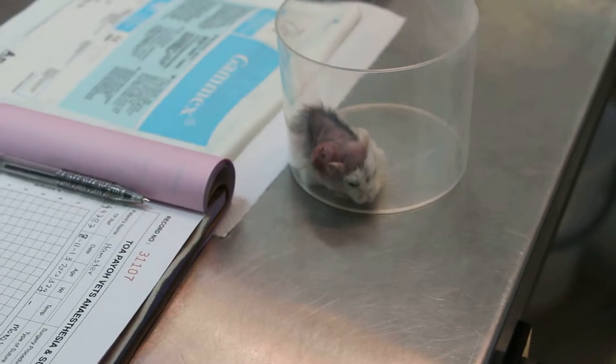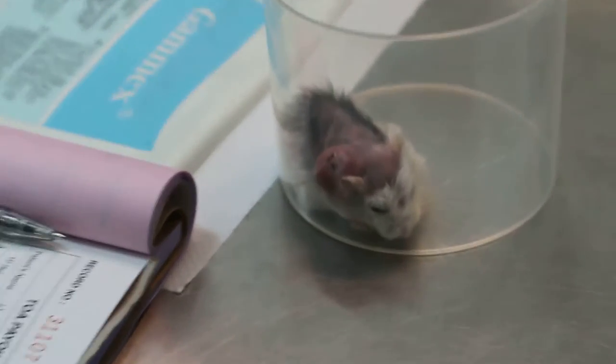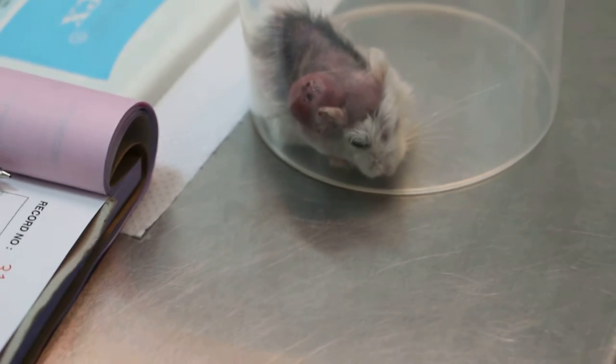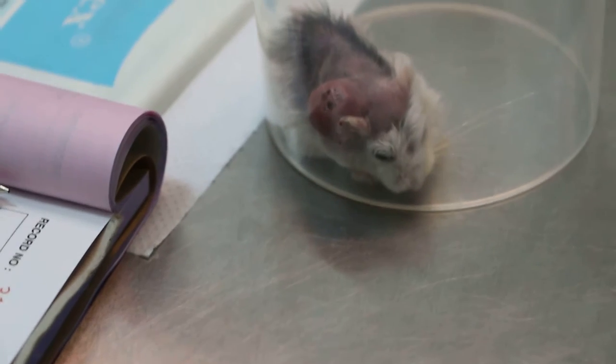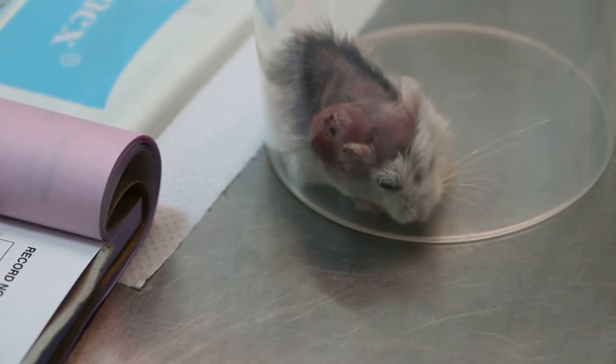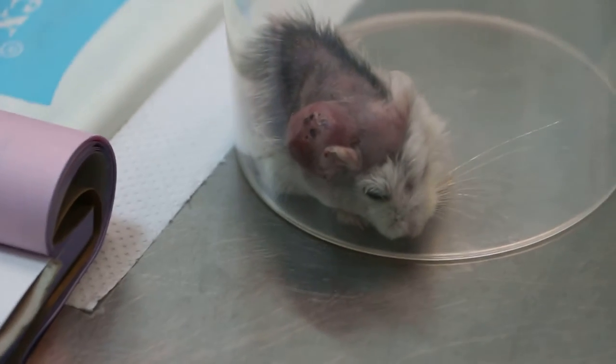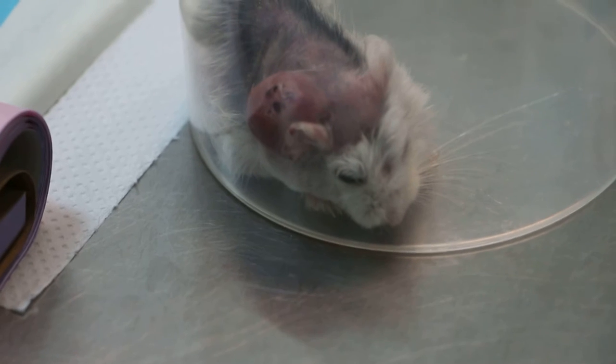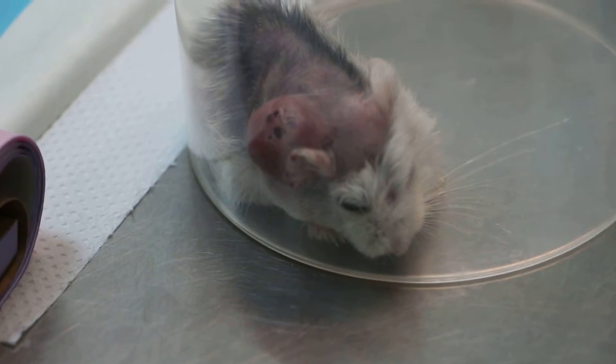Roborovsky male, 2 years old, with right side tumor behind the right ear is being ready for surgery.